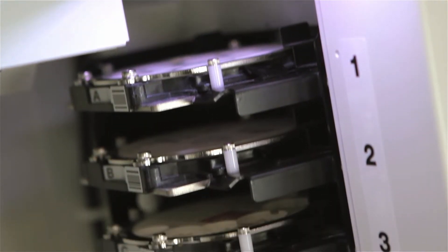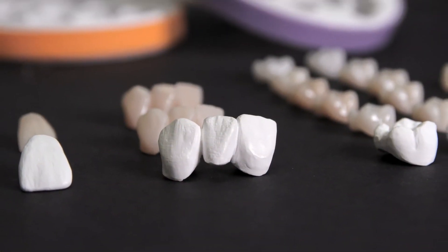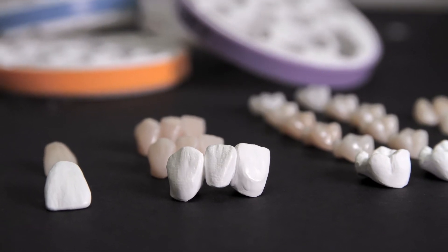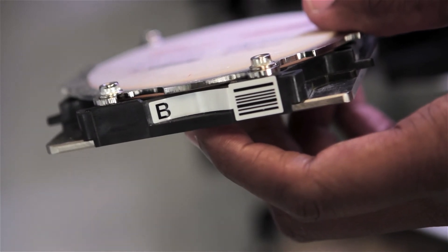The inclusion of the automatic disc changer makes it incredibly easy to manage multiple shades of zirconia, allowing you to use the efficient barcode and lettering system to assign specific jobs on shaded discs.